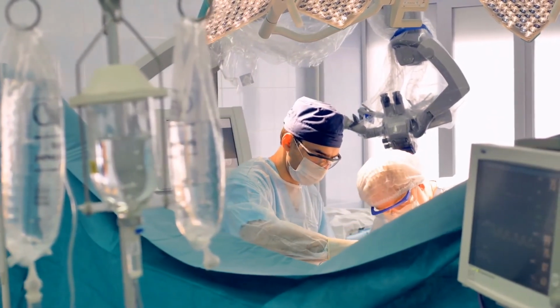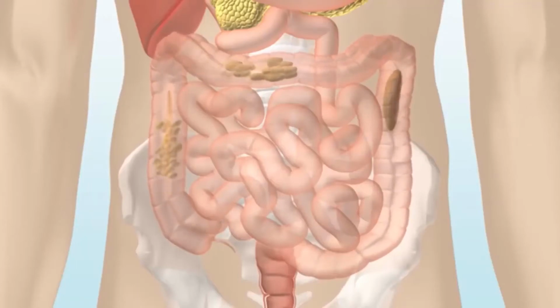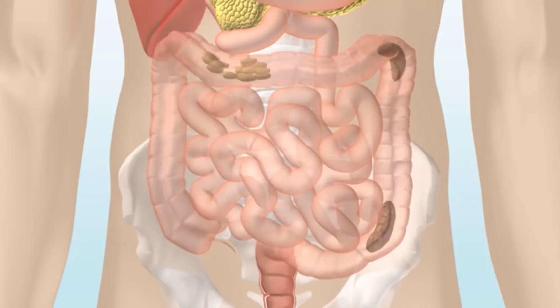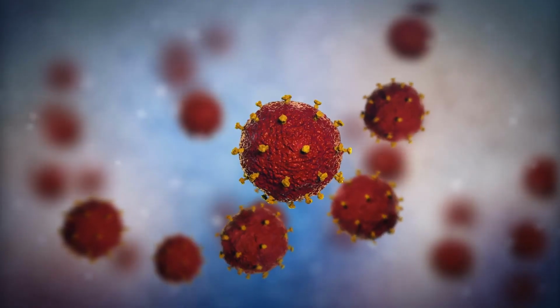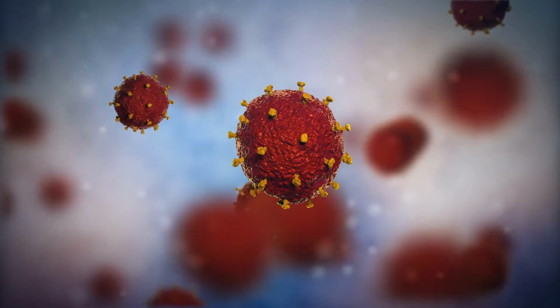Laparoscopy is also preferable to undergoing the more extensive exploratory surgery of the abdomen, since it uses a tiny incision. Exploratory surgery will almost always mean one has to stay in the hospital for at least a few days. In some cases, doctors may also employ microlaparoscopy, which uses an even tinier access, but reveals similar pictures of organs in the abdominal cavity. Microlaparoscopy may ultimately replace regular laparoscopy, since it means even less recovery time for the patient.